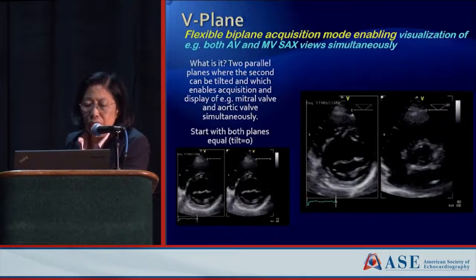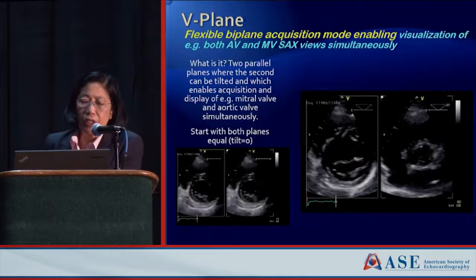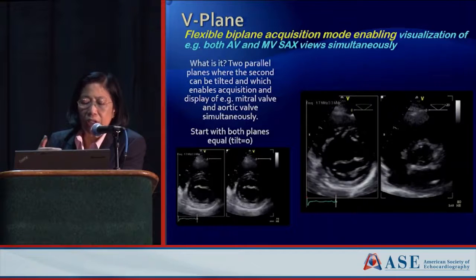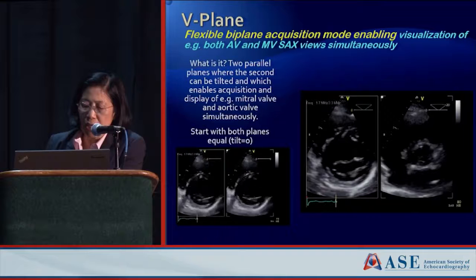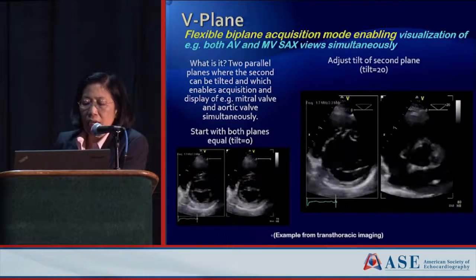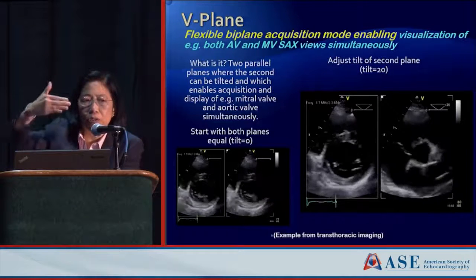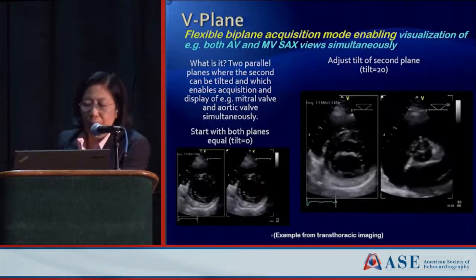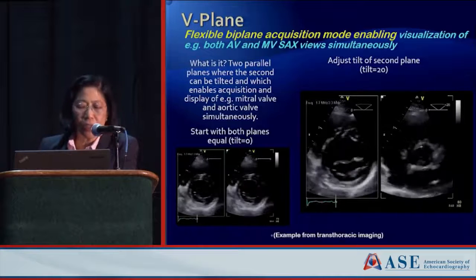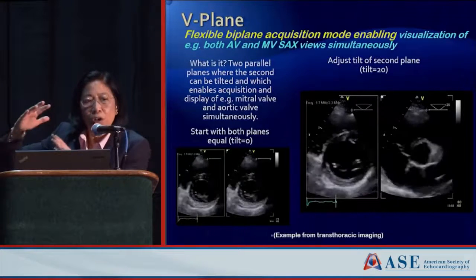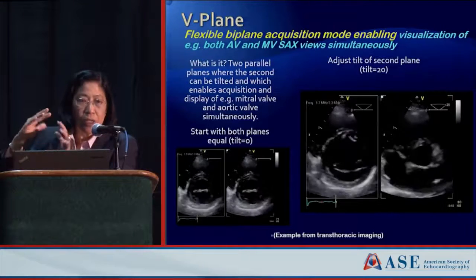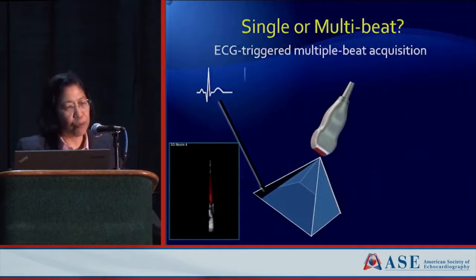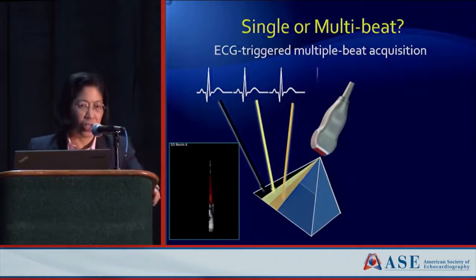V-plane, shown here on transthoracic but similar for TEE, allows you to sit in one plane and tilt in the orthogonal plane in multiple directions. We can stay in a short axis view but tilt within that view — either anteriorly to see the aorta, or posteriorly to see the apex. This ability to tilt in all directions within a 3D volume lets us very easily see structures in multiple aspects of that volume.